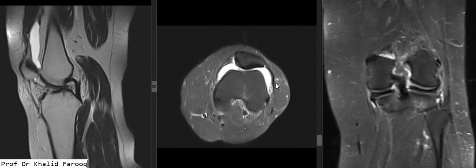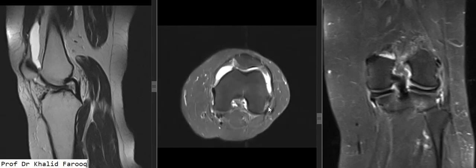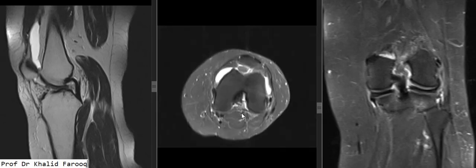The retropatellar cartilage is normal. The medial and lateral patellar retinacula show normal morphology. Here, this is the location of the anterior cruciate ligament, and we see inflammatory tissue over here, suggesting its total transection. This fan-shaped portion is the posterior cruciate ligament.